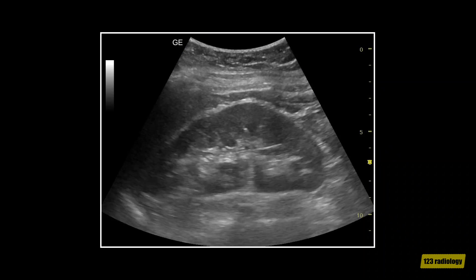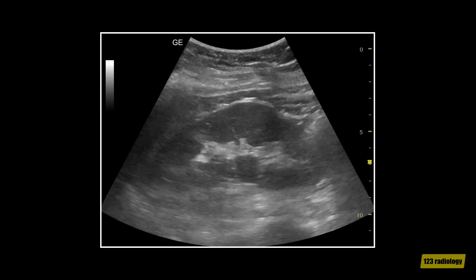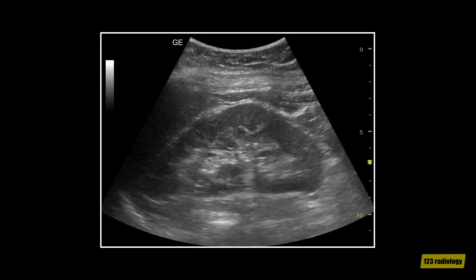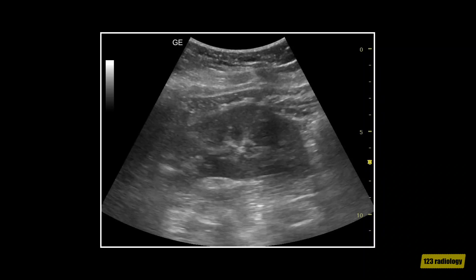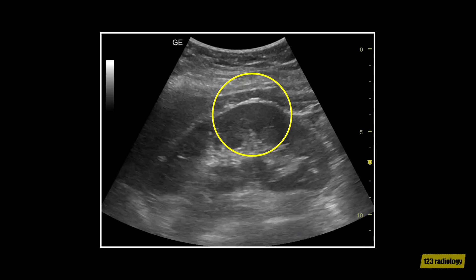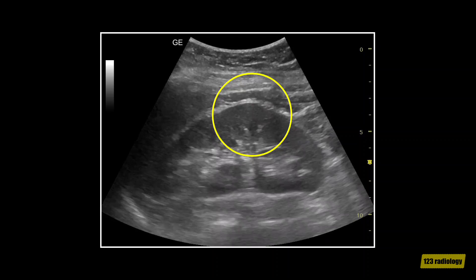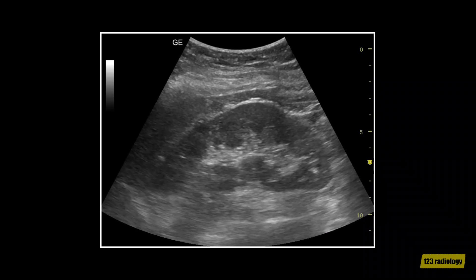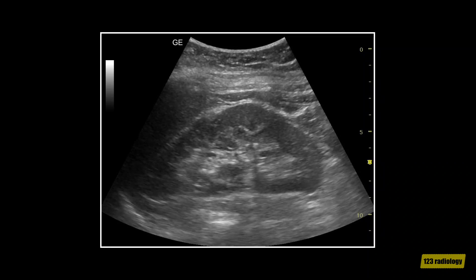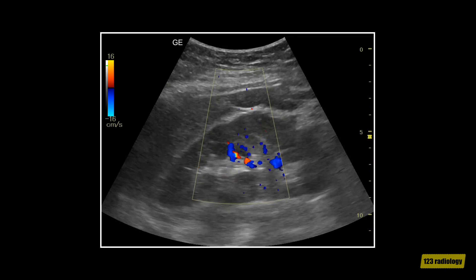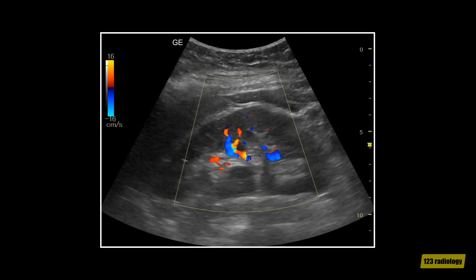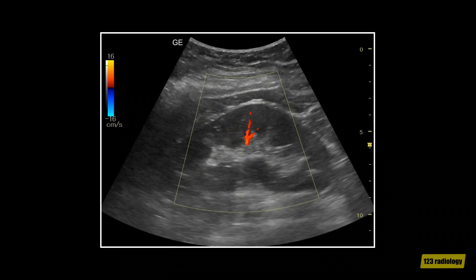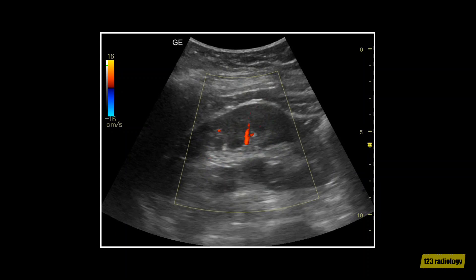This video clip shows another case of dromedary hump. This is a longitudinal view of the left kidney. It shows a focal bulge arising from the lateral border of the left kidney. This bulge shows the same echogenicity as the adjacent normal renal parenchyma. On color Doppler ultrasound, the dromedary hump shows a normal vascular pattern of the renal cortex within the hump.